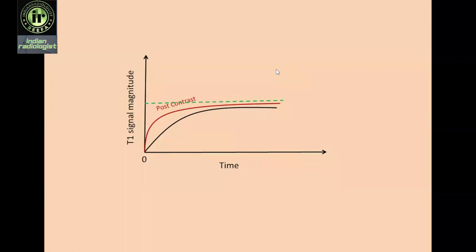So this is a graph I'm showing you. This is plain T1 relaxation without the gadolinium, and post contrast, you can see how rapid the relaxation takes place. So the T1 relaxation time is very much shortened when you inject the gadolinium. Thank you.